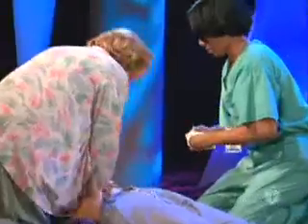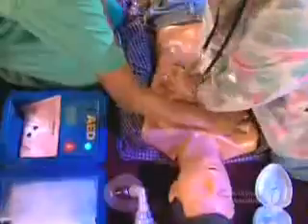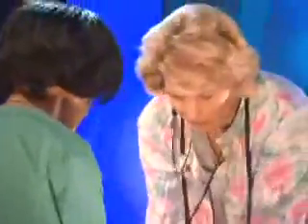Open the AED pad package and peel off the plastic backing. Press the sticky side on the victim's bare chest. Place 1 pad on the upper right side of the bare chest to the right of the breastbone. Put the other pad a few inches below the left armpit.